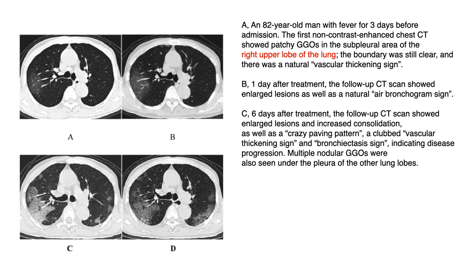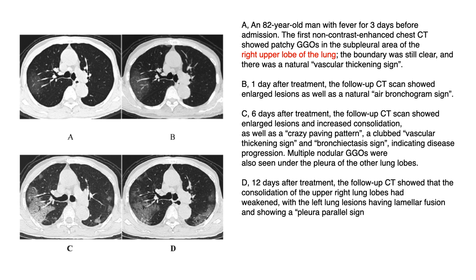Six days after, lesions increased — more like consolidation — and new ground glass opacities appeared on the left side. Crazy paving pattern was also visible. At day 12, follow-up CT showed opacification had reduced — resolving of the disease. The left side nodular lesions coalesced and formed a linear pattern showing lamellar fusion — the pleural parallel sign.